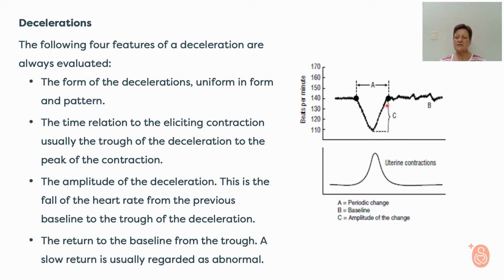Now here you can see it returns fairly quickly. Sometimes it takes quite a long time to go back to the baseline, and that's also more serious than when it returns quickly.